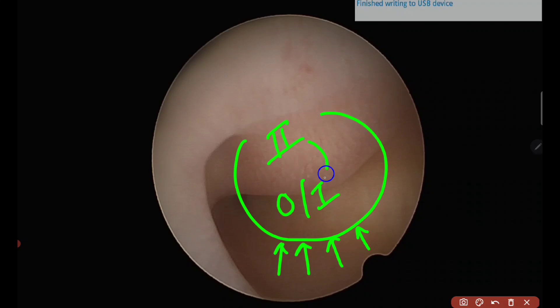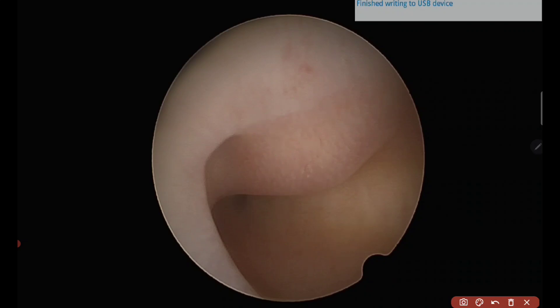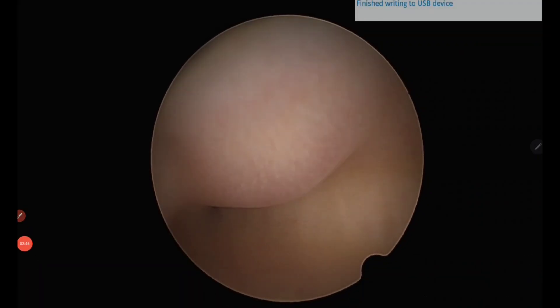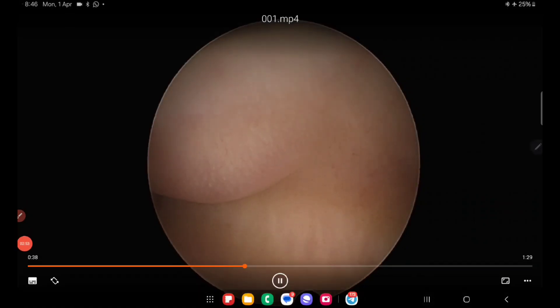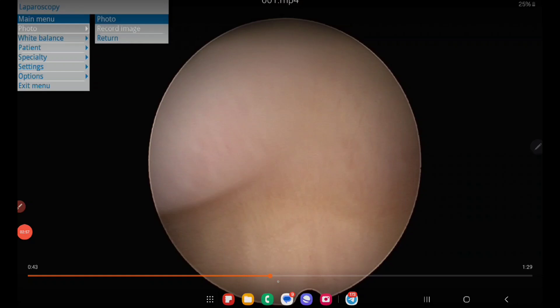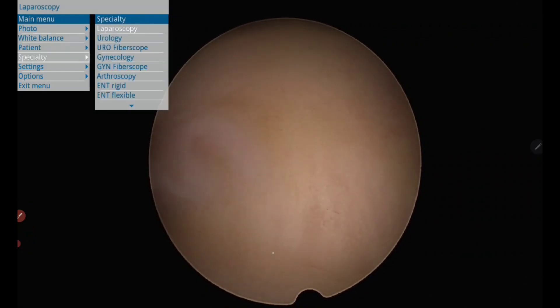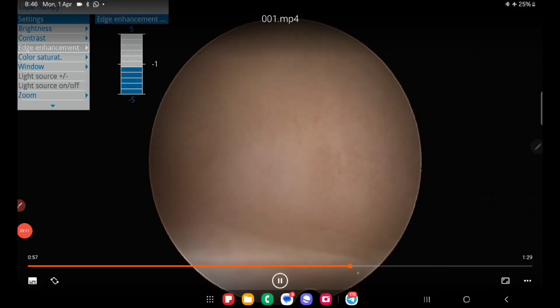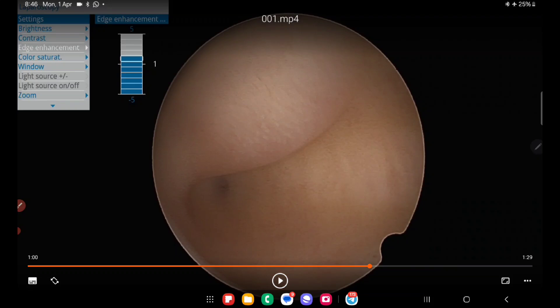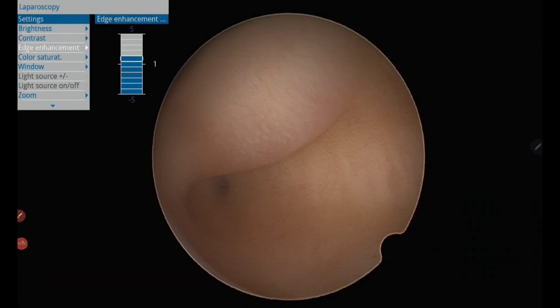Our job is to convert it from type 2 to type 1, making the surgery safer and easier, rather than operating on a type 2 which would require burrowing inside the uterine wall — increasing the possibility of perforation and fluid overload. During diagnostic hysteroscopy, one must quickly scan the uterine cavity for abnormalities and plan the surgery: where the cut will be made, how it will be made, and the end point. Unlike laparoscopic surgery, every minute wasted in hysteroscopic surgery brings the patient closer to fluid overload.